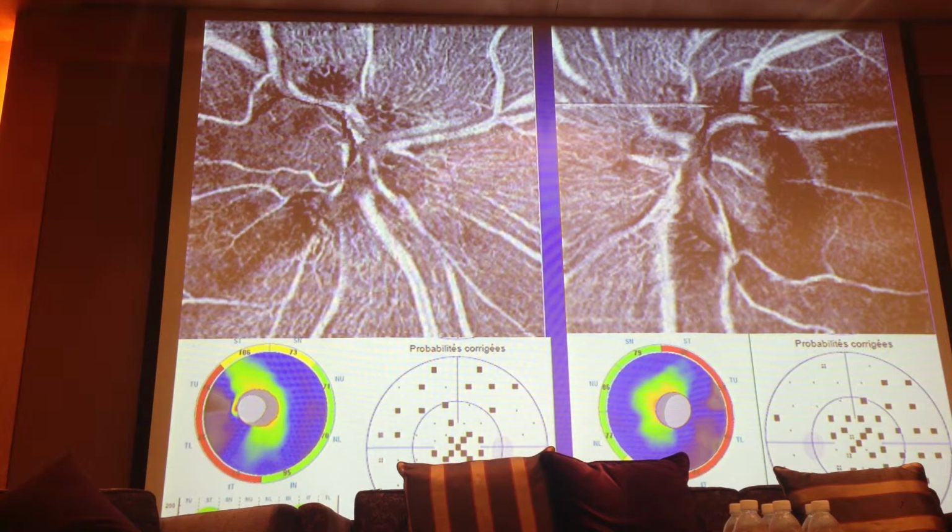Traditionally, doctors, at least in my hospital, always think that visual acuity decreases only at a late stage of glaucoma. But actually, for some glaucoma, especially normal tension glaucoma, patients can get decreased visual acuity at an early stage because of this macular papillary bundle defect. So that's the advantage of this technique, to show the macular papillary bundle defect, and you also have the evidence of capillary loss in that area, which could explain the problem of visual acuity at an early stage.